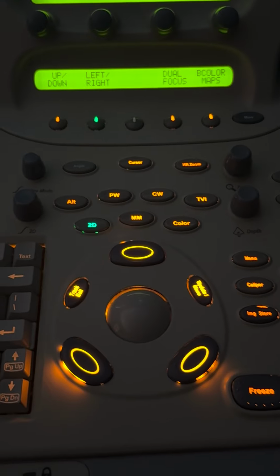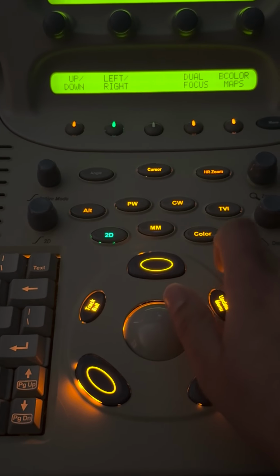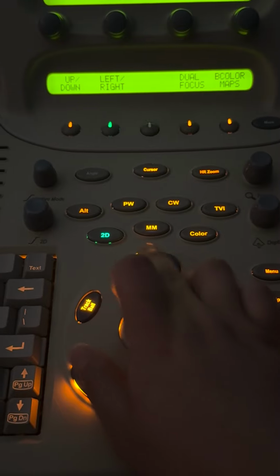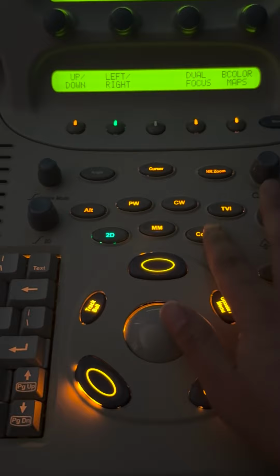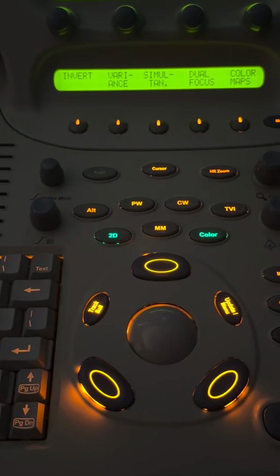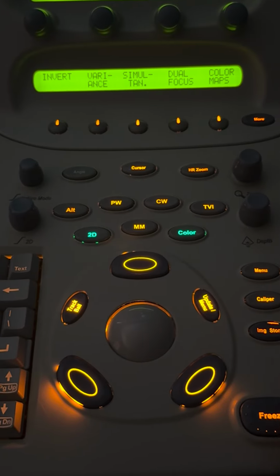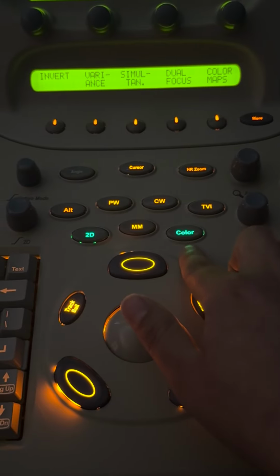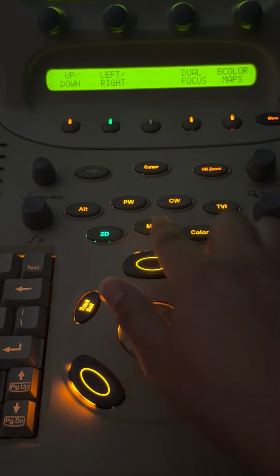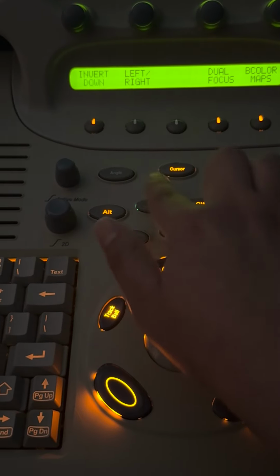These are our other prompts here. So we have our pulse wave, continuous wave, tissue Doppler imaging, our 2D, our M-Mode, and our color Doppler. So to select any of those, you would just click, and you can see, similar to the new unit, if you watch that video, you will notice that the color changes from orange to green when the mode is activated, and that does work for any of these modes.